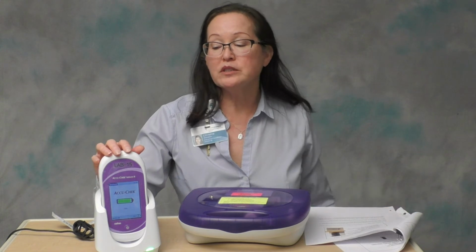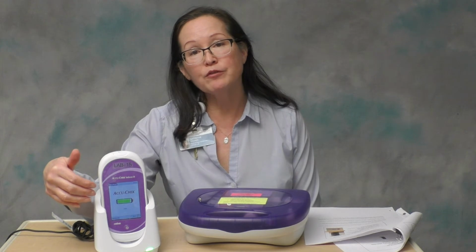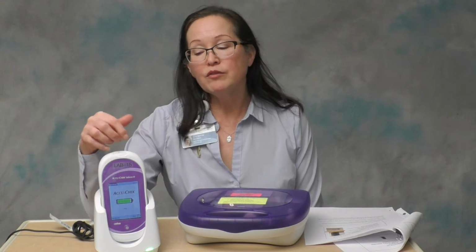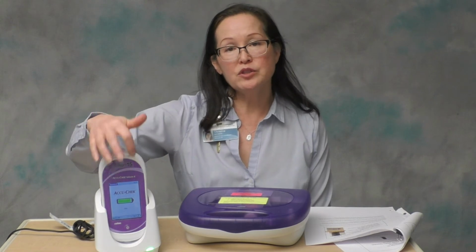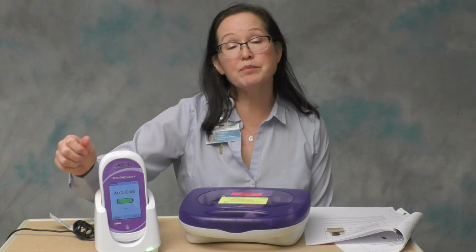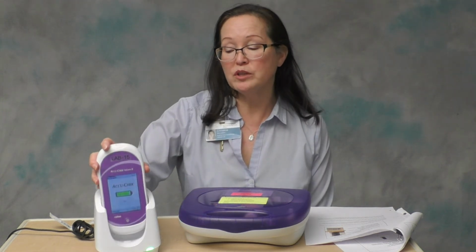Once the meter is docked correctly and recharging, the screen will go black after 2 minutes. This is an energy conservation mode. And you can tell if it's docked correctly, if it's sitting here with a black screen, by just tapping the screen. If you tap the screen or press the on-off button, the display should light up and show you that large battery icon that indicates it's docked correctly and charging. If you tap the screen and nothing happens, it remains black, that indicates it's not docked correctly. So you should pick it up and redock it.